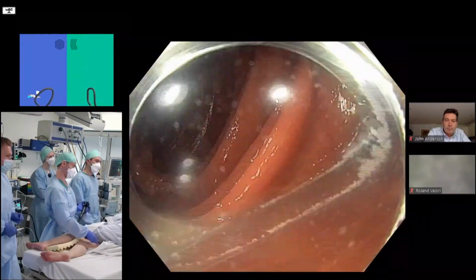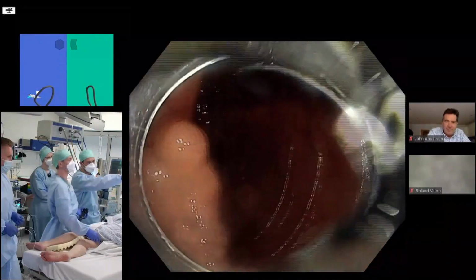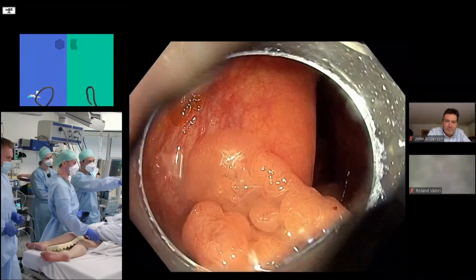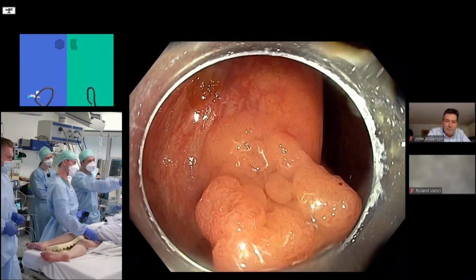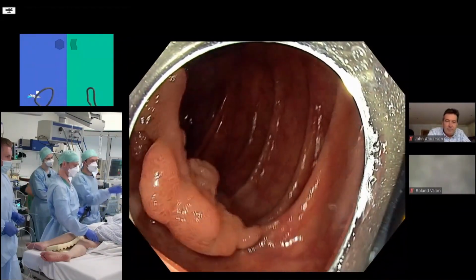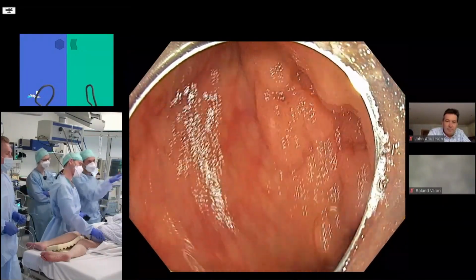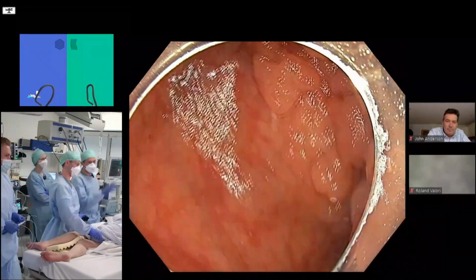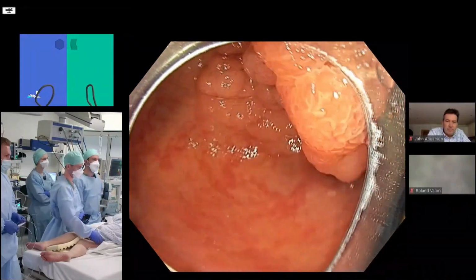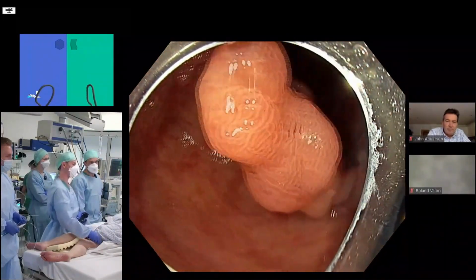So the problem with that, as John will immediately start shouting out in a minute, is that if you do that, you're going to be sitting down onto polyp when you cut. So maybe it's not the most ideal place to start. Another place you could start might be down here on this flat part. You could bring that out and start getting into the plane there, because of course this thing is over a fold. So it's going to require at some point you to access that area.